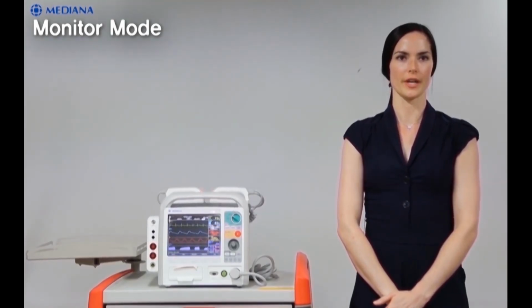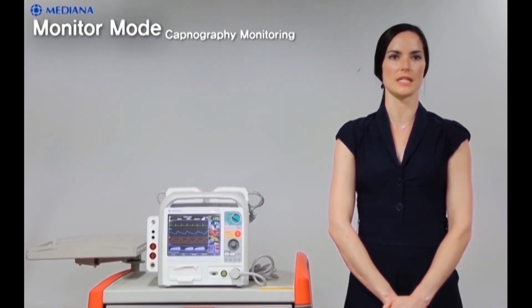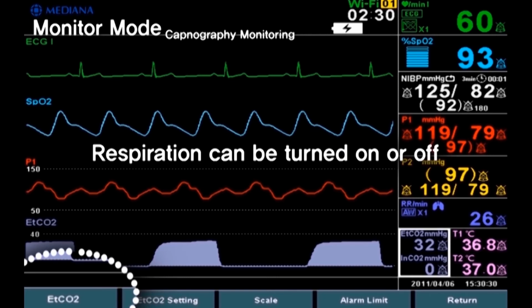Now let's move on to the capnography monitoring. Here you can see how the EtCO2 measurements would be presented on the screen. Here are the options of the EtCO2 menu. Number 1. In EtCO2, respiration can be turned on or off.